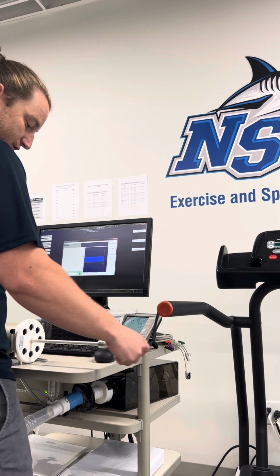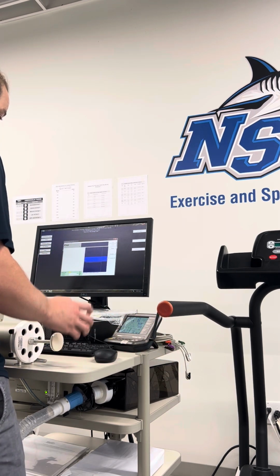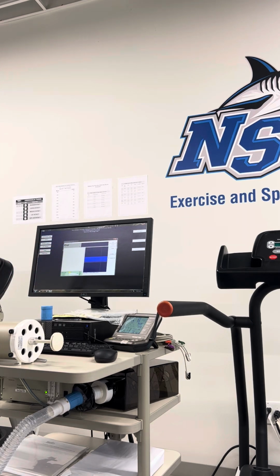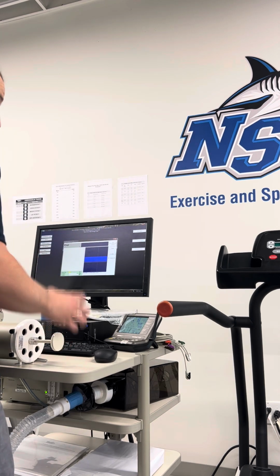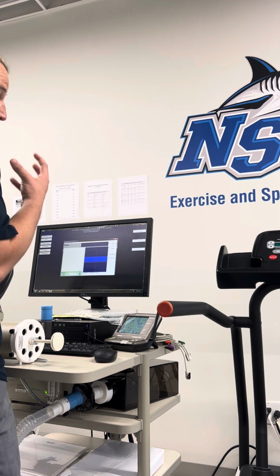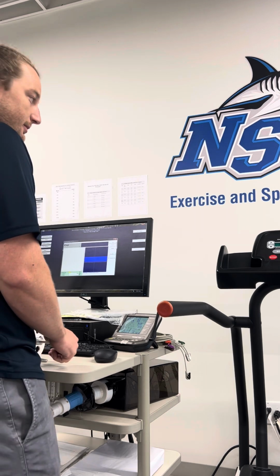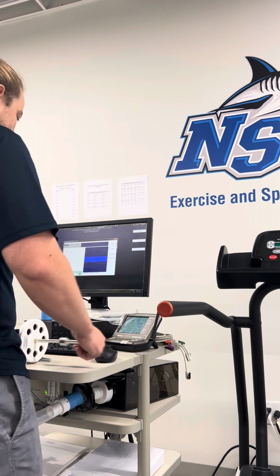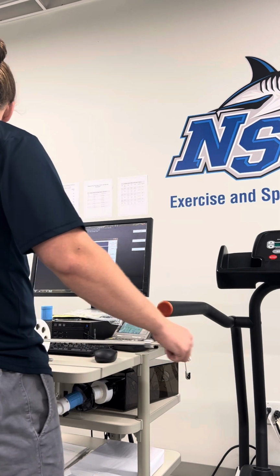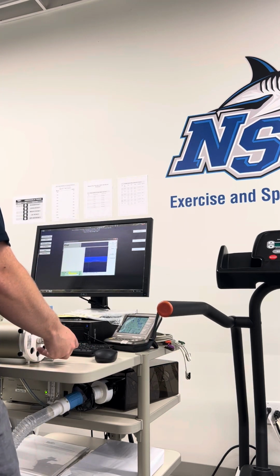The first one is the detection stroke, to make sure you're live, make sure the systems are up and running. The next 4 strokes are taking the air from the tube and pushing the air into the metabolic cart to make sure that it's warming the air up enough to get the accurate feel of what respiration will feel like from either exercising or an RMR test, into the tube, into the metabolic cart to heat the air up. So 4 flushes, just to make sure we're getting that air to the metabolic cart properly. Or the gas chamber would be more appropriate.